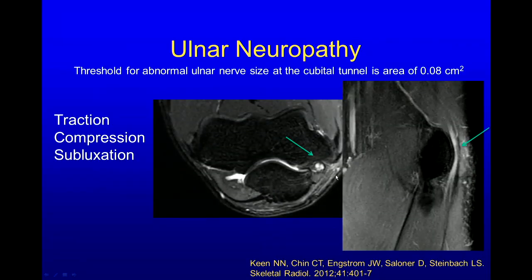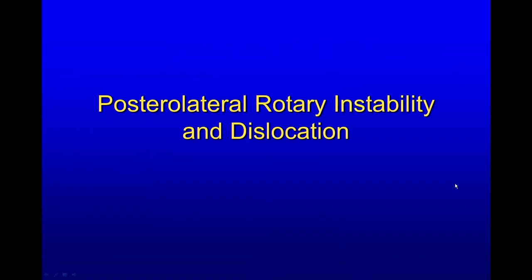Here is the ulnar nerve in the cubital tunnel. We know it can have a little bit of high signal on T2 weighting in asymptomatic individuals. We did a study where we looked at the size of the nerve and found a threshold of 0.08 centimeters squared for calling it enlarged, which was more helpful than signal. You can suggest ulnar neuropathy if you see high signal or enlargement. On sagittal images, this one was symptomatic — it's pretty big and high signal.